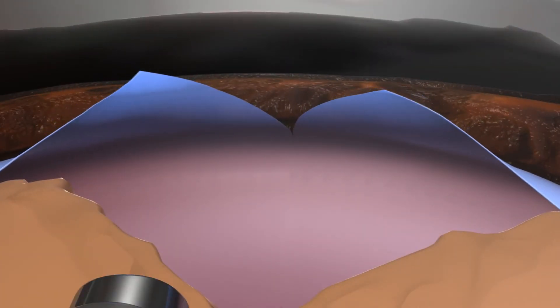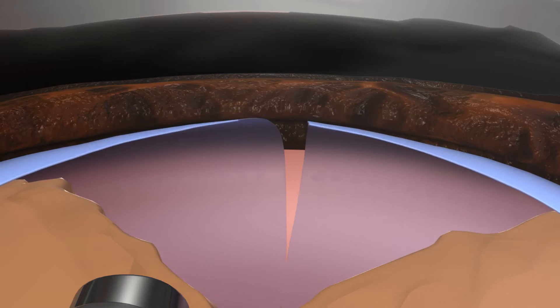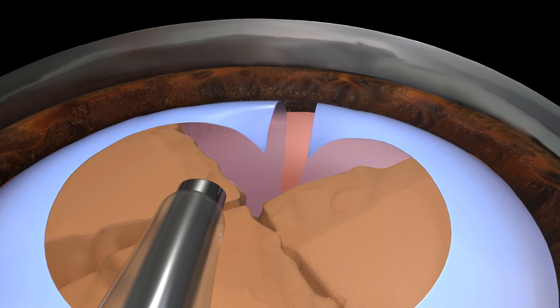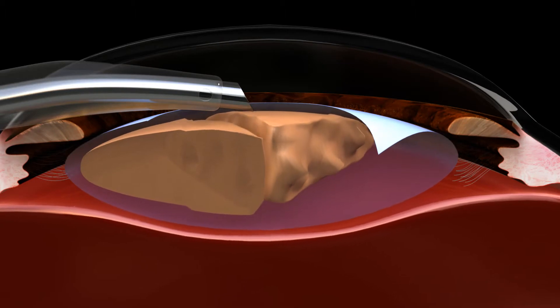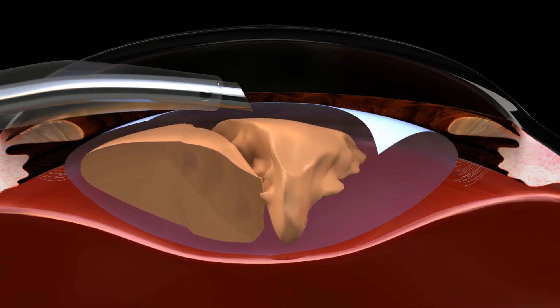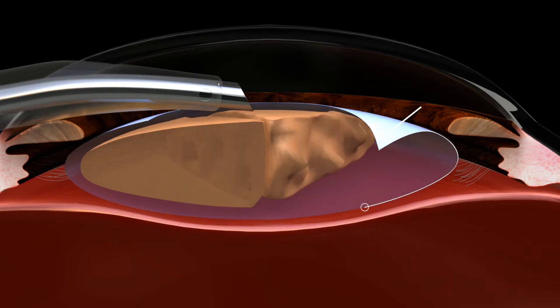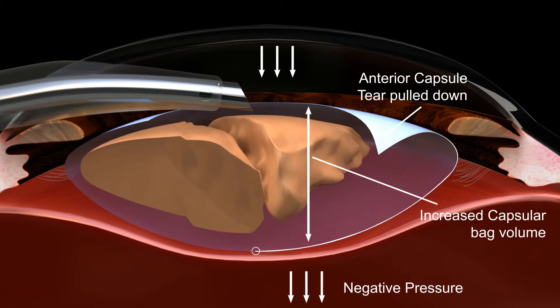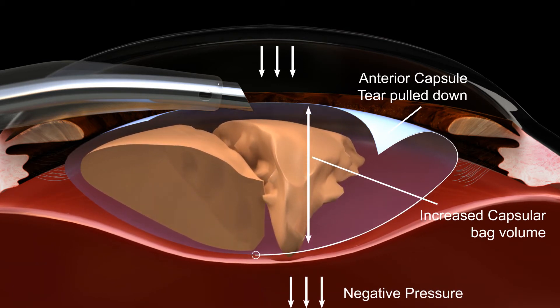When the flap stops fluttering and becomes flat, it indicates extension beyond the equator onto the posterior capsule. When the flap becomes inverted, it indicates further extension of the tear. If phacoemulsification is continued, there can be a nucleus drop. With post-equatorial extension, the continuous down-pulling makes the flap taut, flat, and then inverted, making it unresponsive to pressure dynamics. Thereby, high intraocular pressure in the AC, fluid dynamics in the bag, the weight of the lenticular content, and posterior segment negative pressure cause further extension of the tear and the bag contents to move posteriorly.